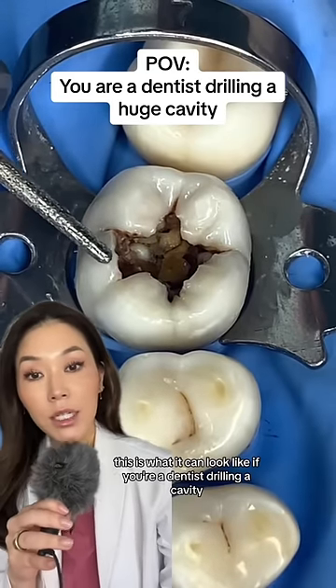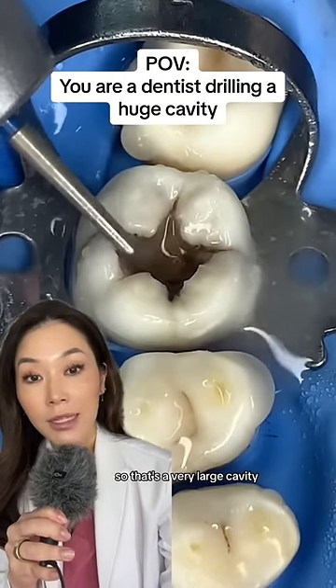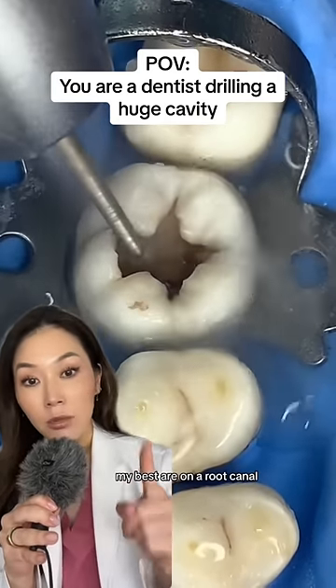This is what it can look like if you're a dentist drilling a cavity. I have a bad feeling about this one — that's a very large cavity. We'll see exactly how deep it goes and whether it's going to need a root canal. My bets are on a root canal.